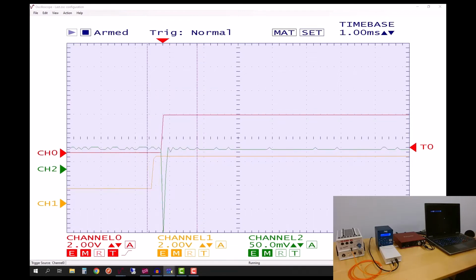And the orange signal is obviously jumping around. That's the one that's coming from the Biosemi USB serial trigger cable. That jitter might be a little less if we were using a sound card that was optimized for presentation, like one of the Sound Blaster devices that they recommend.